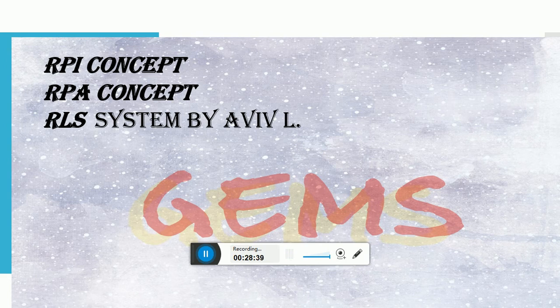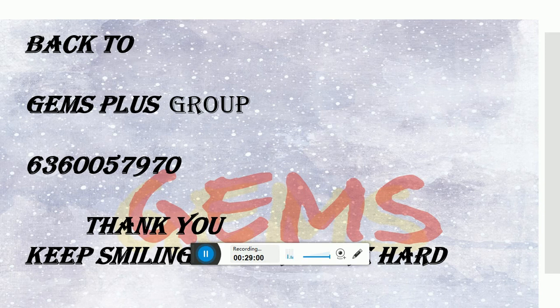Gingival health is better in circumferential clasp, it is poor in the bar clasp. Aesthetics in bar clasp is excellent, and in circumferential clasp it is poor. Tolerance is good in the circumferential clasp, it is poor in the bar clasp.